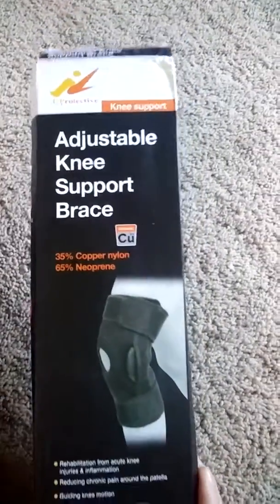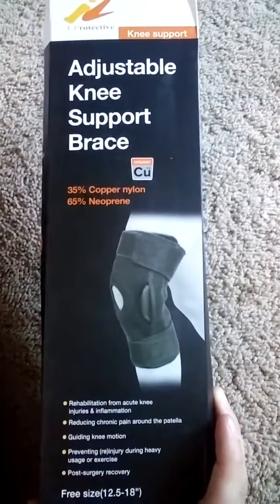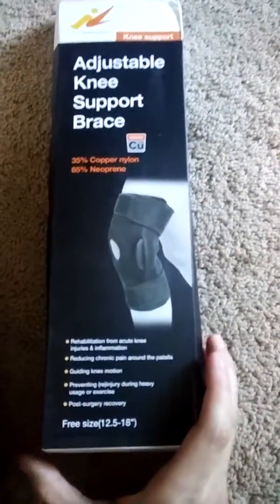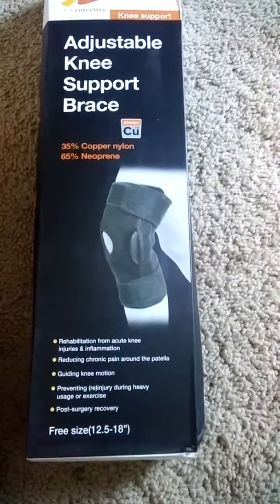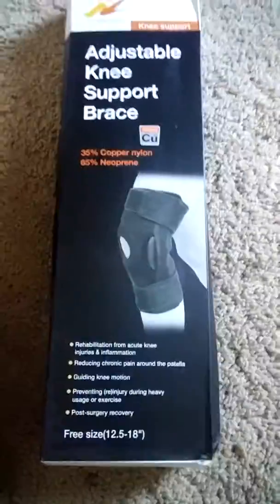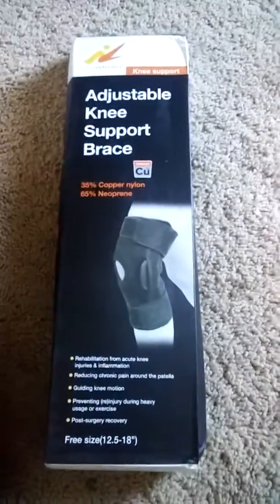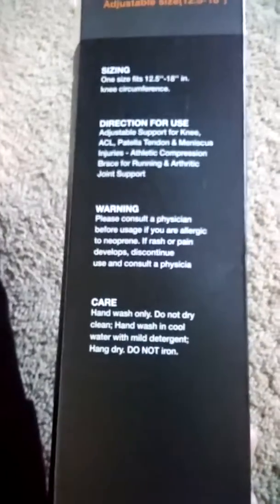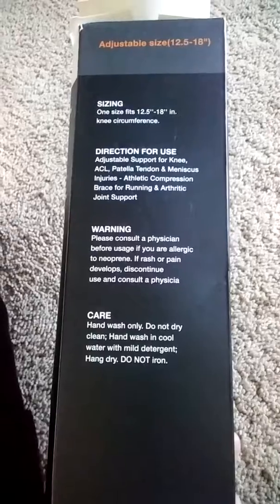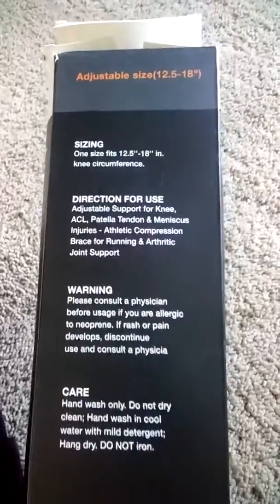The knee support, provided for free in exchange for an honest review, is made out of copper, nylon, and neoprene. It's designed to help with inflammation and pain, and to keep your knee from popping out or dislocating during exercise or after surgery. It does recommend you talk to your doctor before using. It's hand wash only and one size fits all — 12.5 to 18 inches around.